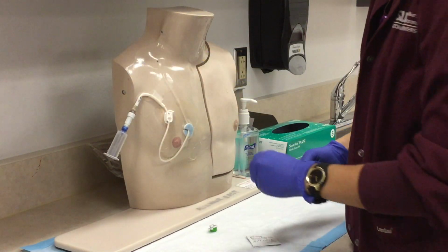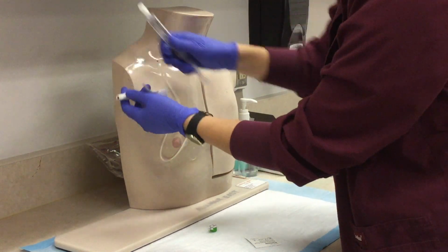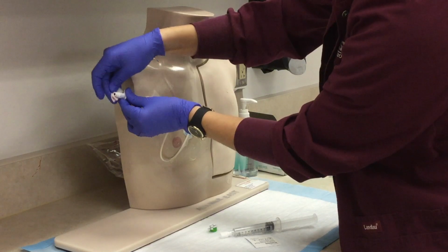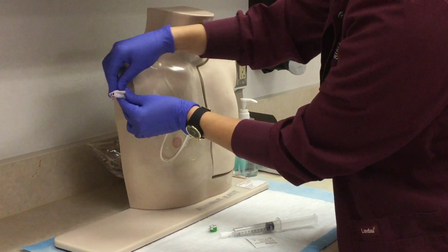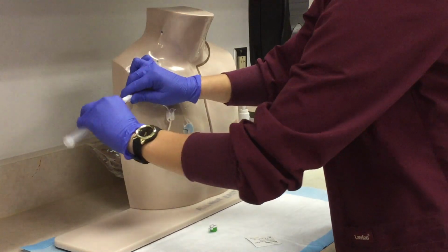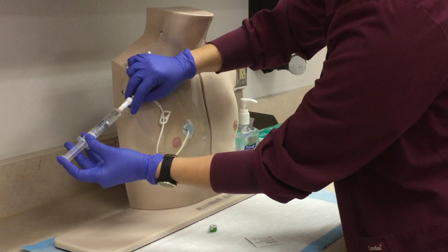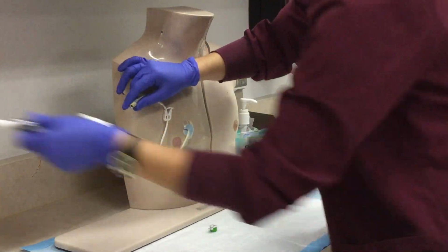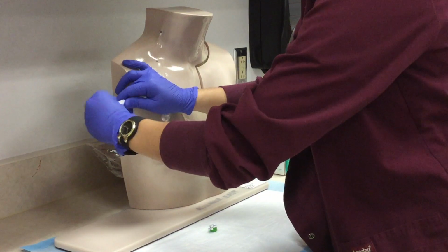Remove the vacutainer, clean the hub, and let air dry. Attach a 10 milliliter flush, unclamp the line, and flush the line with another 10 ml or per policy. After flushing, clamp the line again, remove the syringe, and dispose of it in the biohazard container. Clean the hub again with alcohol and place a disinfecting Curos cap on the hub if indicated by policy, or reattach any IV tubing and restart infusions.